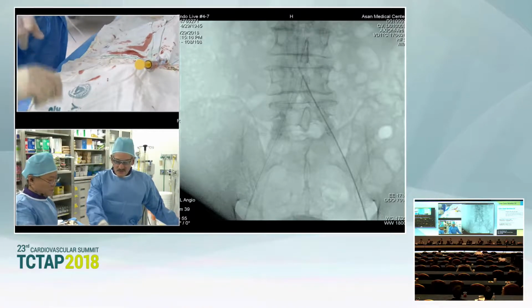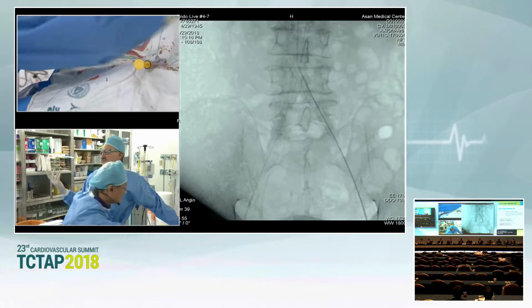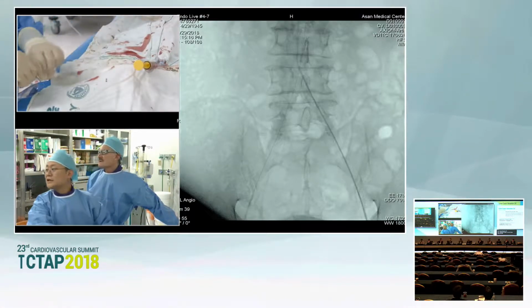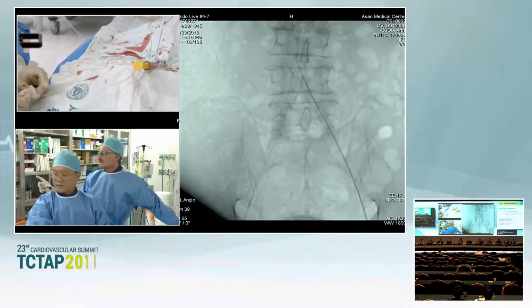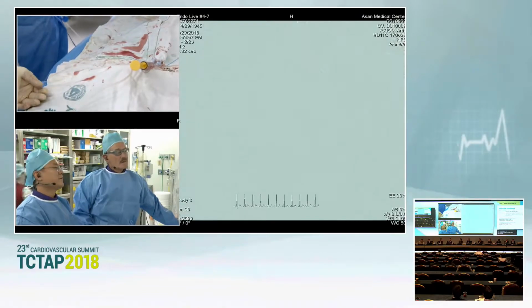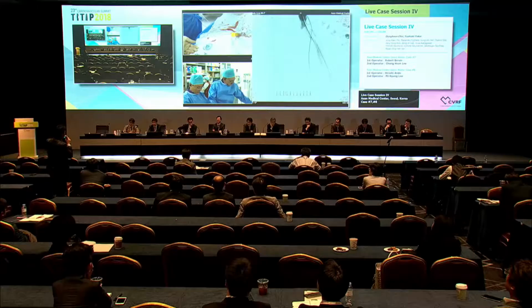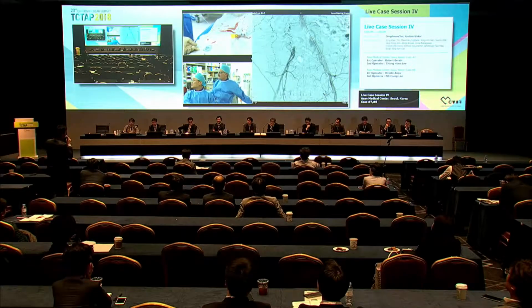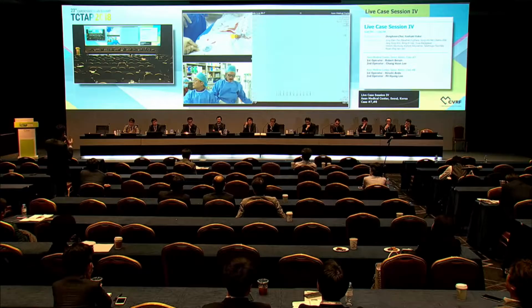So let's go ahead and wipe this down. Let's just have a 3 millimeter by, do you have a long 3 millimeter? Like 60. Sometimes if the wire passes the proximal portion, a short wire cannot be expected after this subintimal space, right? So Dr. Ida's mention is very important.